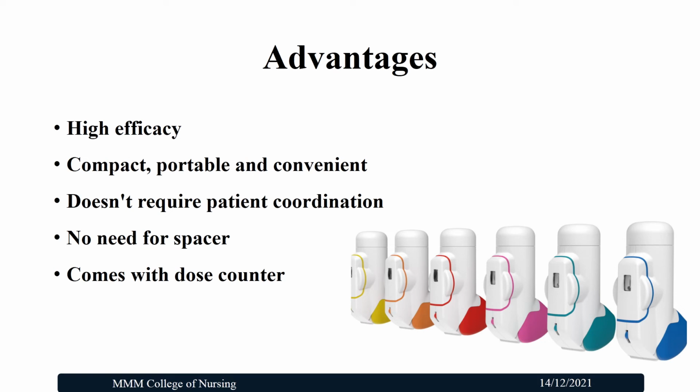The advantages are, it has high efficacy, it is compact, portable and convenient for the patient to carry all the time. It doesn't require any patient coordination and less skill is required, there is no need for a spacer, and it comes with dose counters. So very easily the patient can identify how many doses remain.